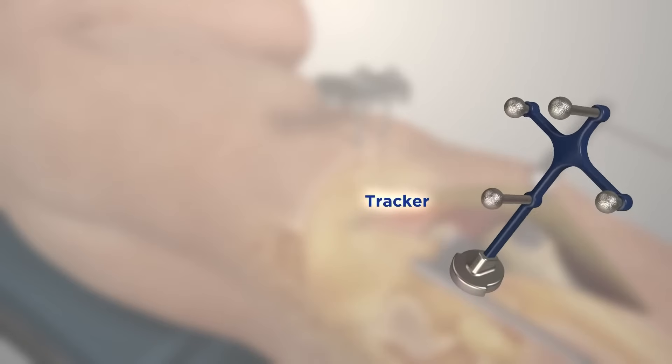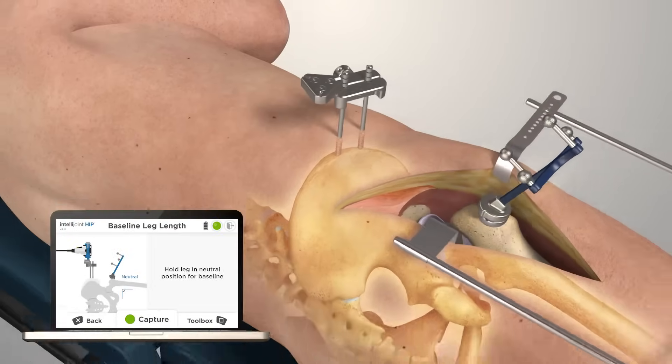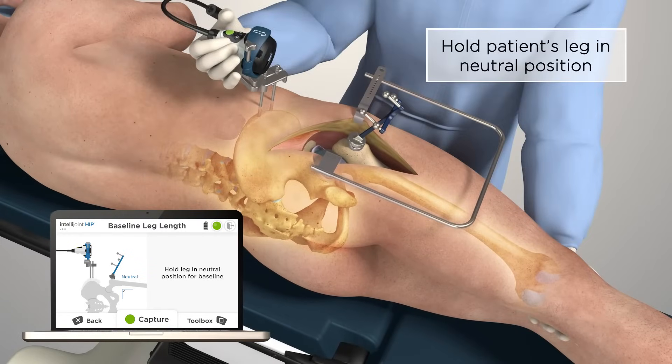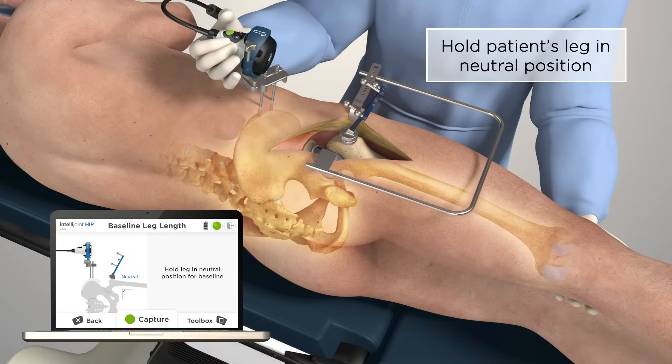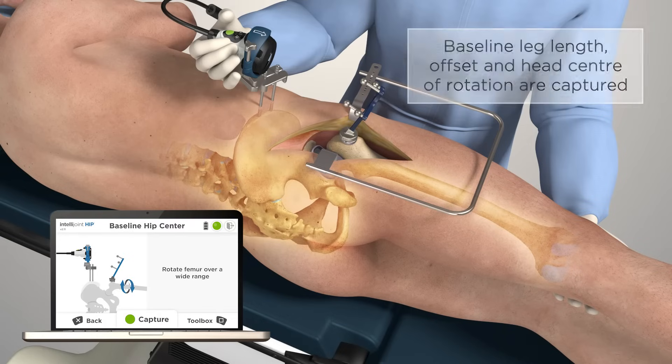A magnetic mount is used to attach the tracker to the femur platform. Ensure the patient's leg is in the neutral position and capture the baseline position. Articulate the leg to capture the native hip center.